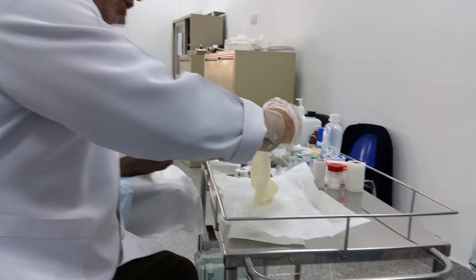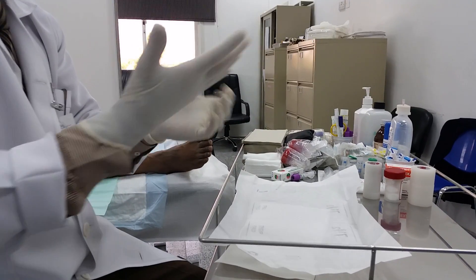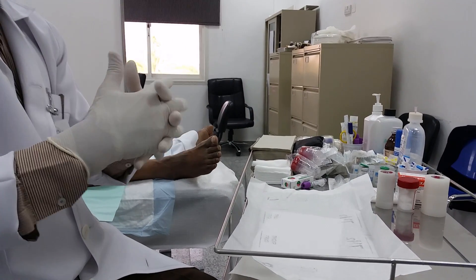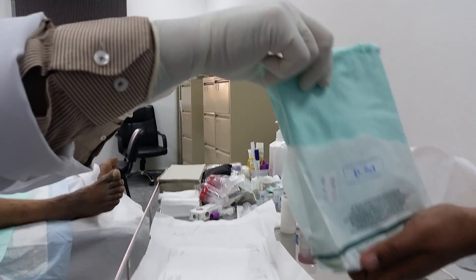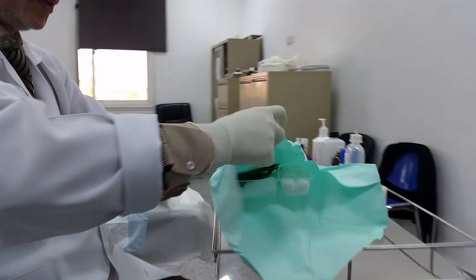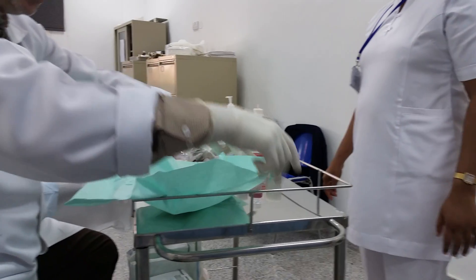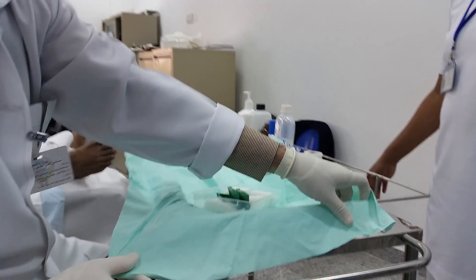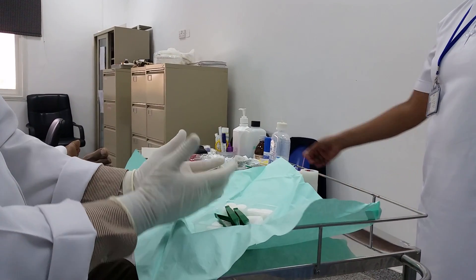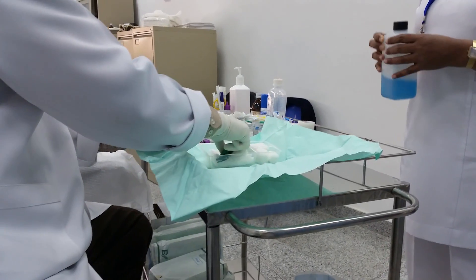You are not touching the gloves. You can use plastic gloves if you are sensitive to rubber. I will open the sterile drape — you should be careful not to touch the tray or the table. I will put the sterile drape over the edges, because I may touch it to support my hand during handling my tools and needles.